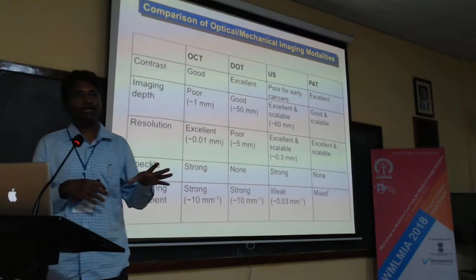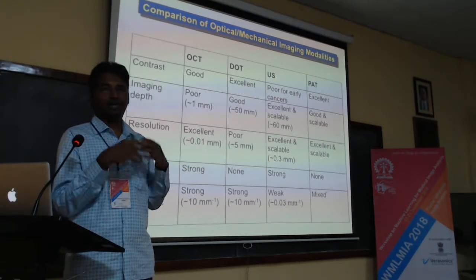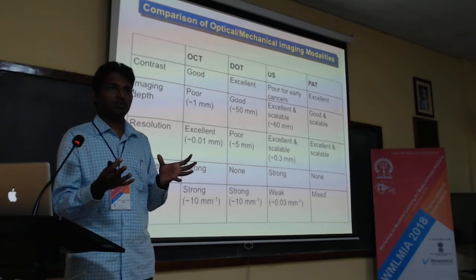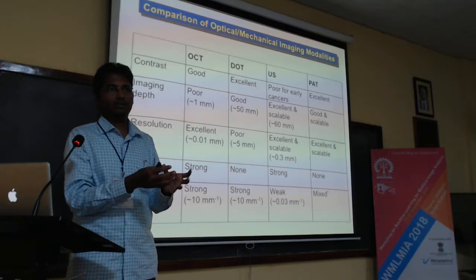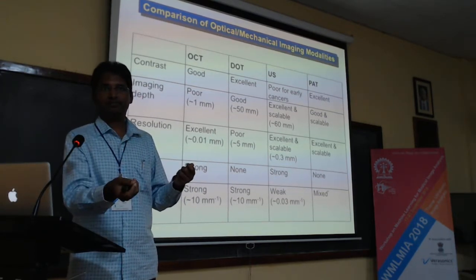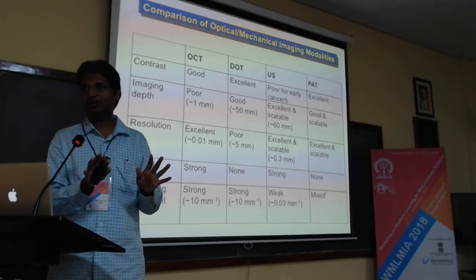But having said that, whether it is transmission or detection, or generation or detection, actually the technology is almost the same. It uses the same RF electronics. The only thing is that you are switching between generating and detecting. So in terms of cost, it doesn't really reduce any cost.